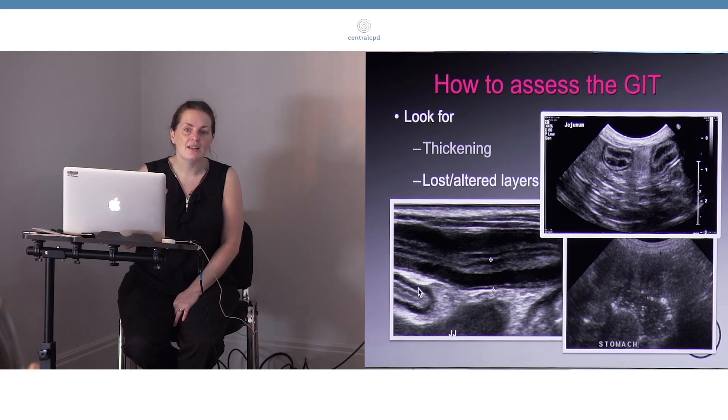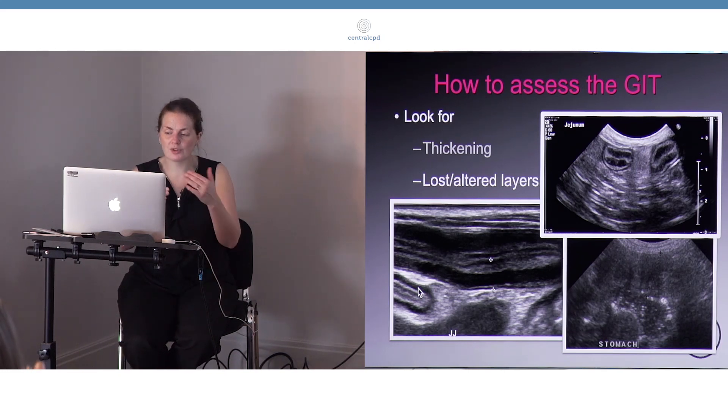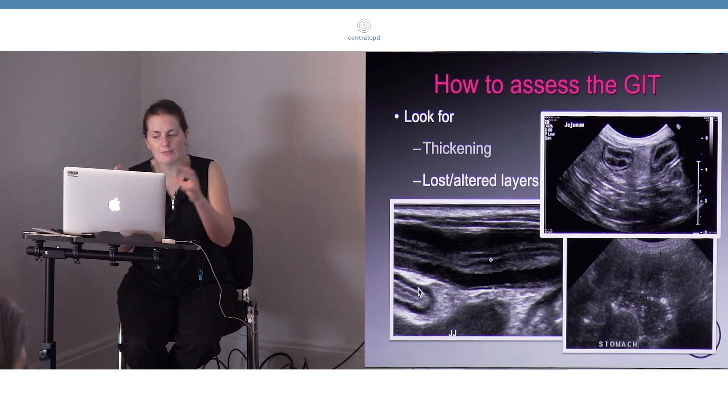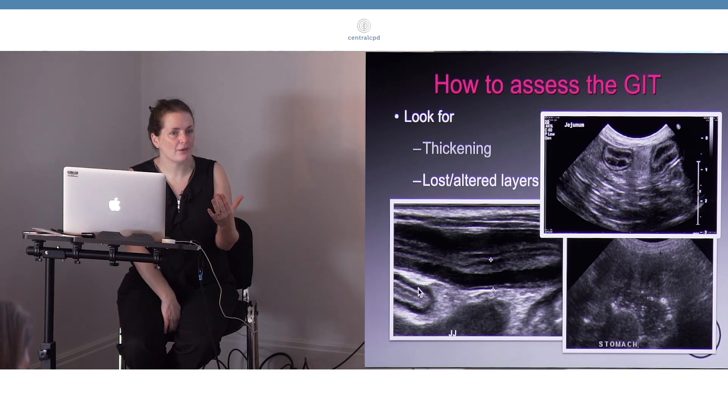That can be associated with a variety of different things. Altering the proportions of the layer, particularly with muscularis thickening, can be seen particularly in cats associated with inflammatory bowel disease.